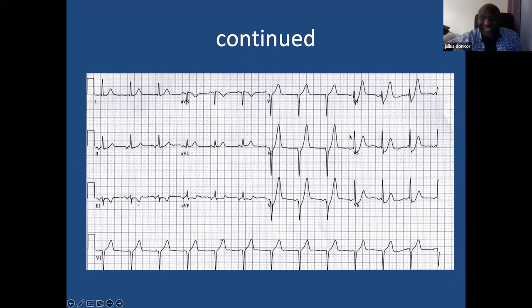So De Winter's T wave is often missed by people, especially maybe registrars, A&E or whatever, or even cardiology registrars. It's an emergent MI, full blown MI. Maybe in a few hours you get full blown. So do not mistake that. This is coming. And so you get this particular pattern with upsloping ST depression, morphing with a hyperacute T wave, and you're looking at V2, V3, which might extend into V4 as well. So that's LAD, and you can already see reciprocal changes in inferior leads. Sometimes it's really, very subtle. You can't see it.